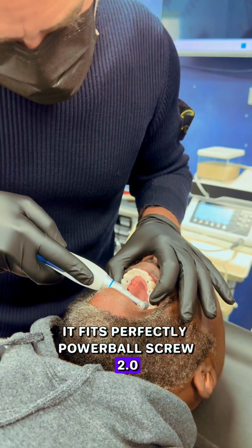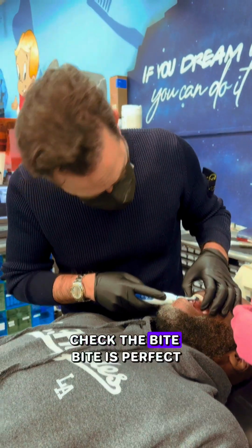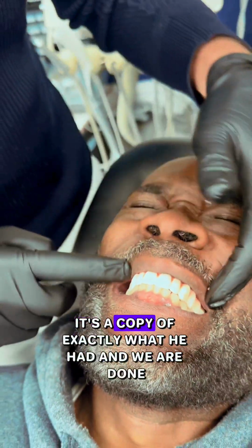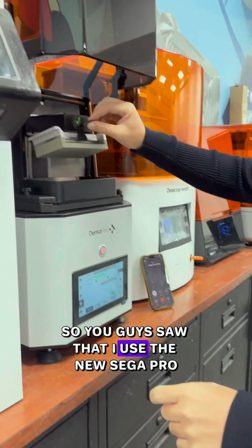Powerball screw 2.0. We torqued these to 15 newtons, no more than that. Check the bite. Bite is perfect. Smile is perfect. Patient's really happy. It's a copy of exactly what he had. And we are done. So you guys saw that I used the new Sega Pro.